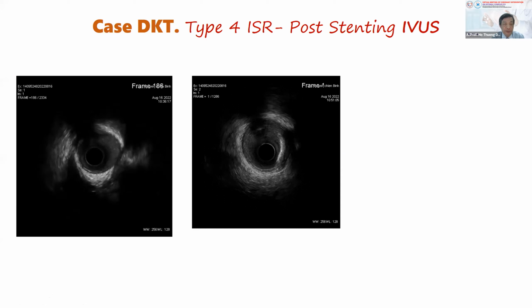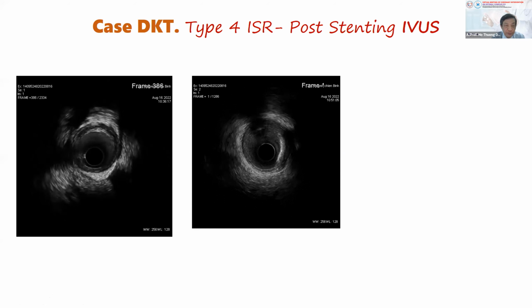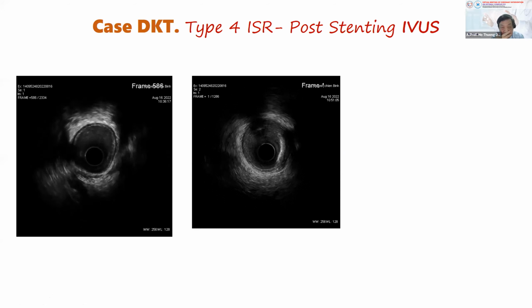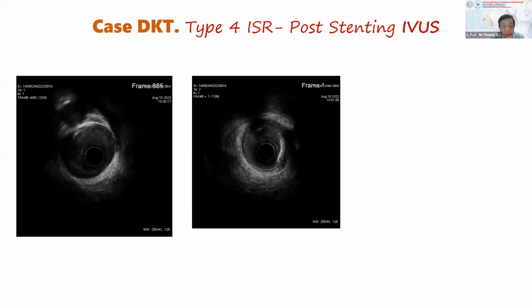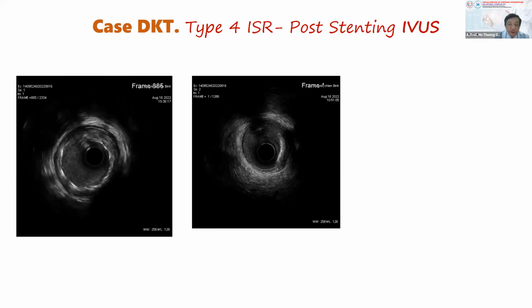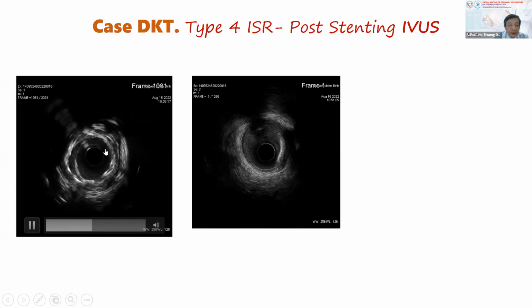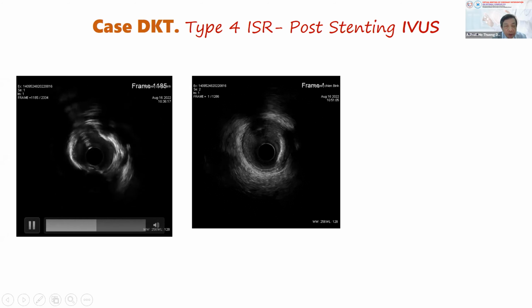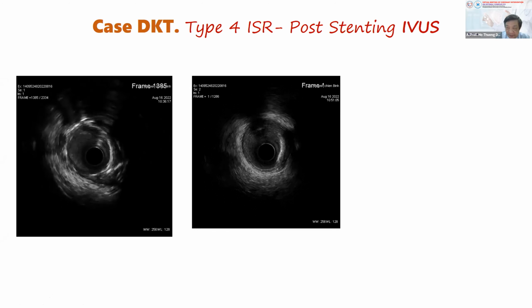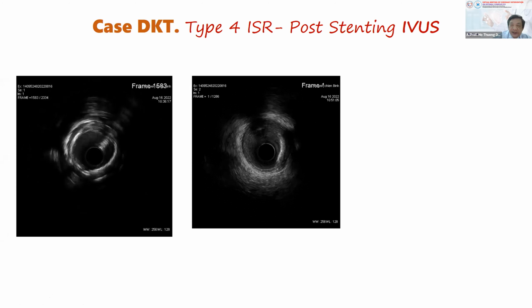For the LAD from inside to outside. Then the reverse stent. This stent is good, but we can see type 1 and type 2 under-expansion in combination with neo plaque and neo calcification. The lesion from the mid-stent to the ostium.